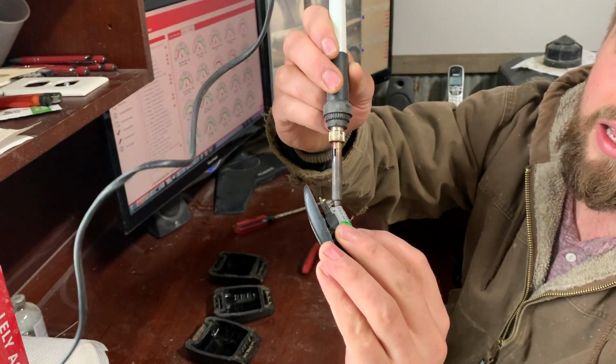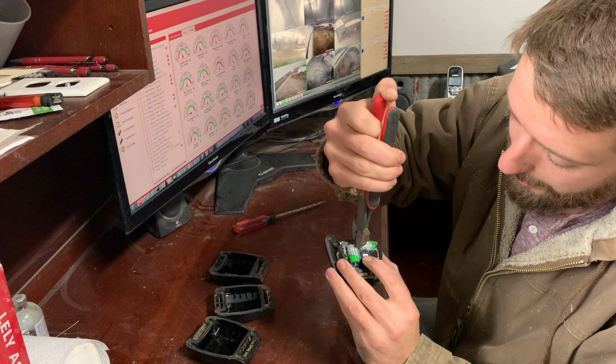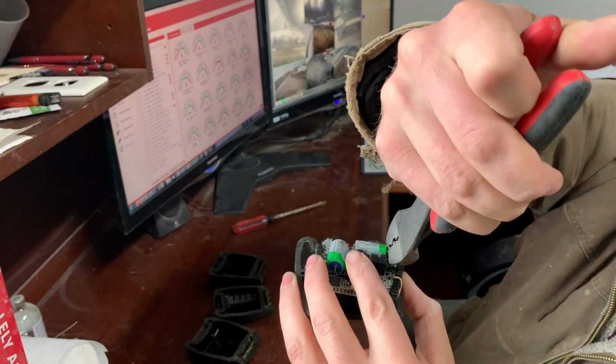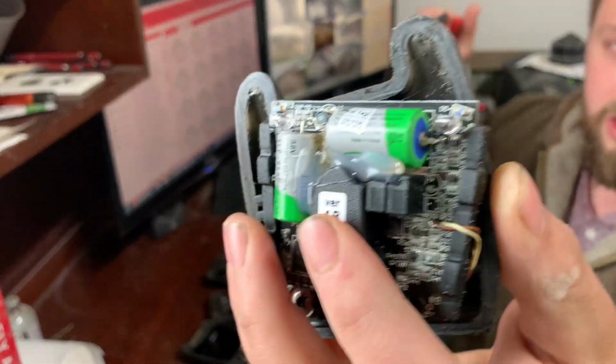So after I have that heated up and some of the caulk out of the way, I just go ahead and get my wire snippers and snip. I usually like to cut the ends of the wires there and, instead of soldering off of the board, I usually like to just solder the ends of the new ones together.